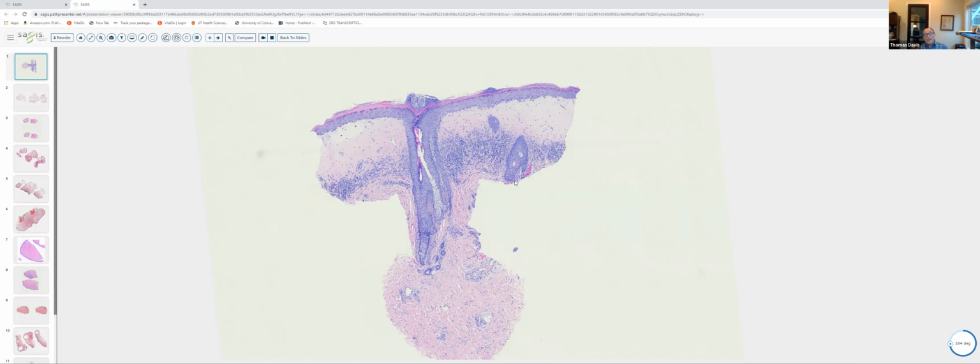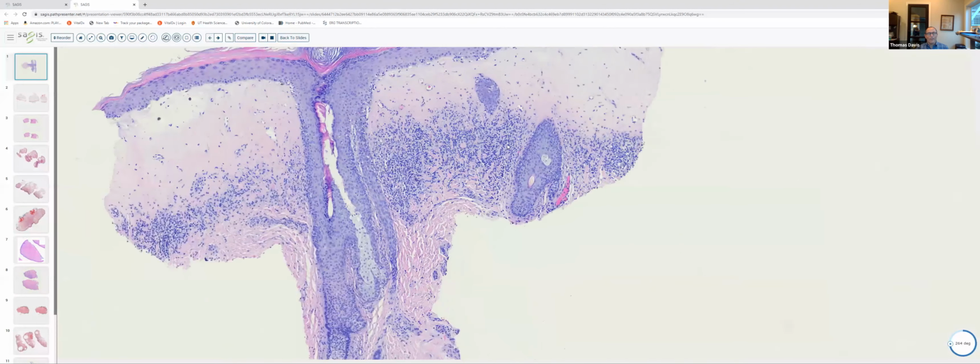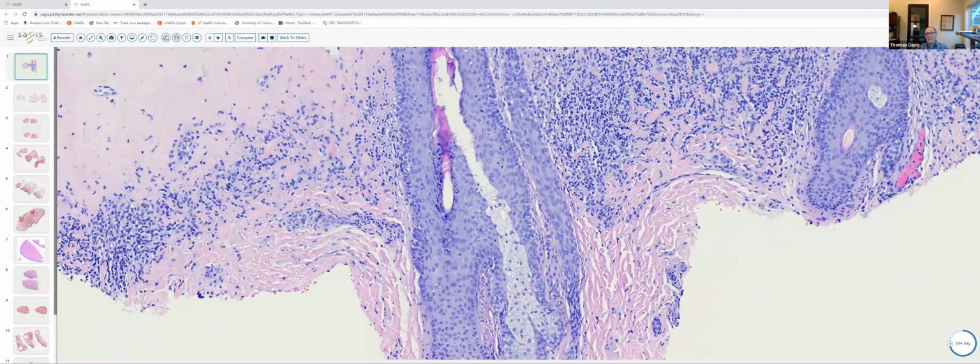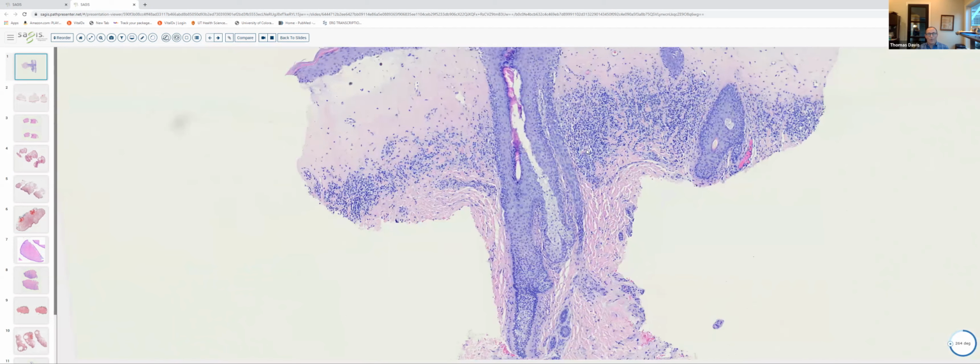papillary dermis. The condition can be pruritic, and so sometimes one will see superimposed lichen simplex chronicus. Because it's pruritic and gets scratched, you can sometimes get quite a bit of hemorrhage in the papillary dermis. One last point: recently, people have begun to recognize, and it's been written about in the dermpath literature, that early LS sometimes will have a few eosinophils within the infiltrate as well.